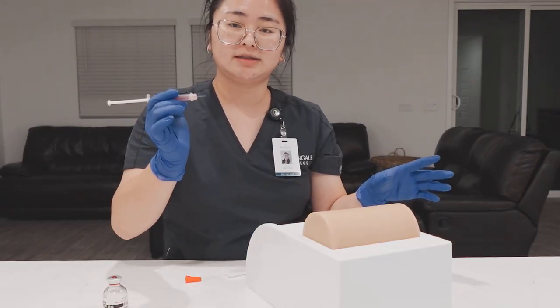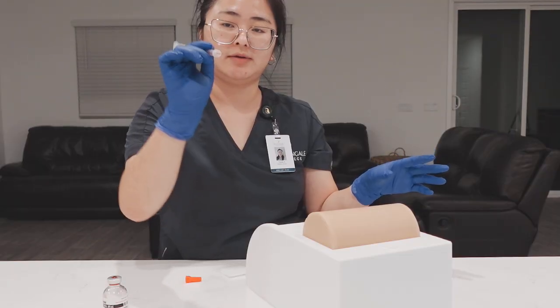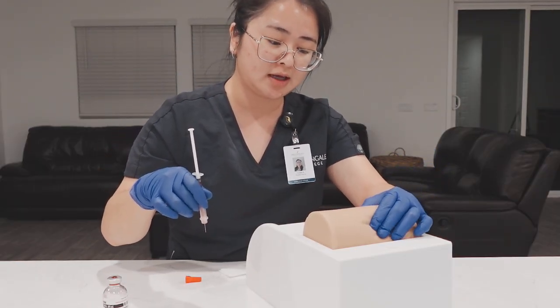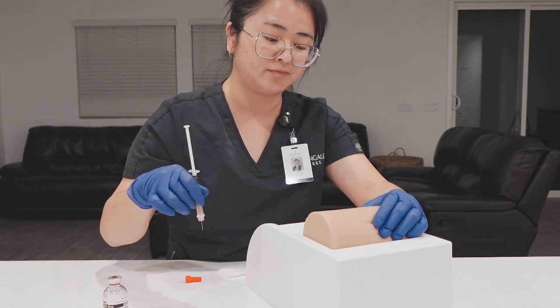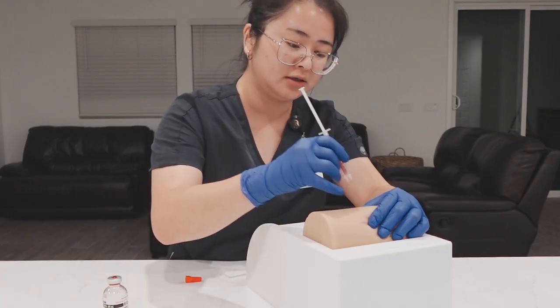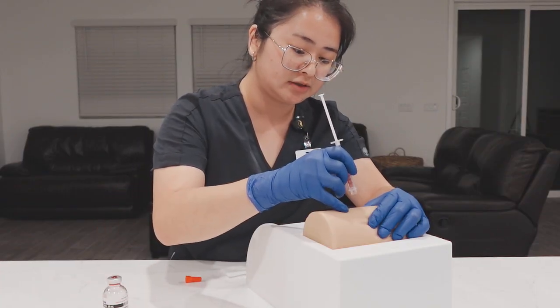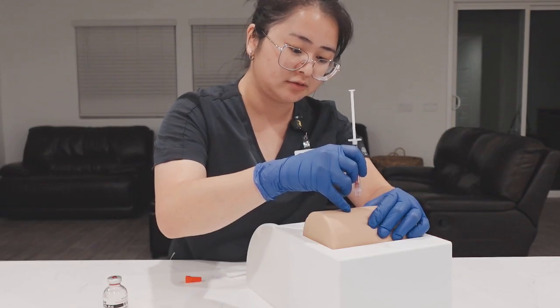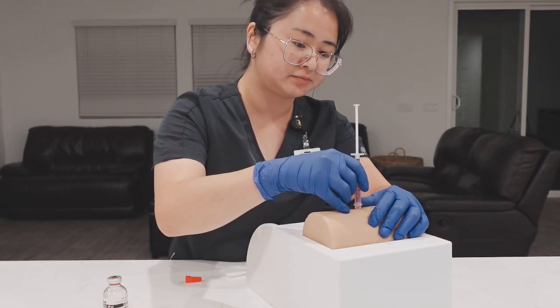And when we administer this, we have to hold it like a dart, with the palm downward. When we administer it, it must be quick and firm. Quickly and firmly, we have to administer it at a 45 to 90 degree angle. So 45 to 90 degree angle. So, 90 degree angle. Okay.